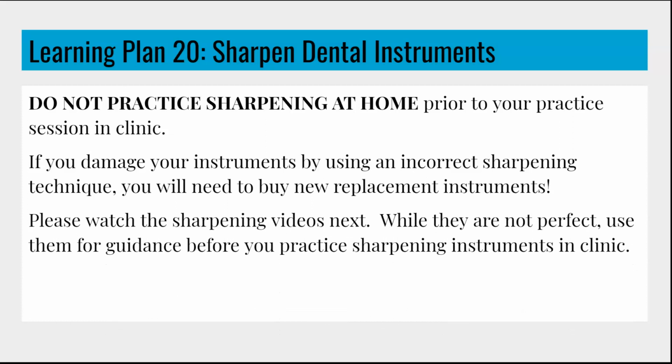Please watch the sharpening videos next. While they are not perfect, use them for guidance before you practice sharpening instruments in clinic.